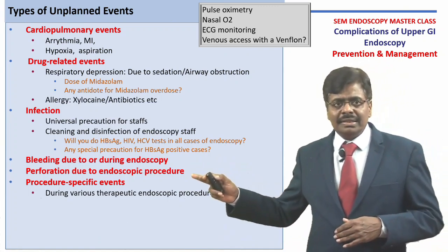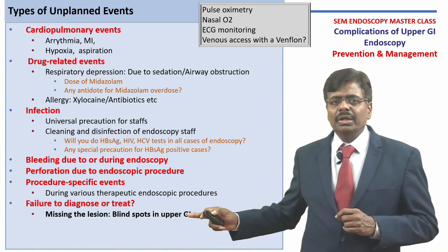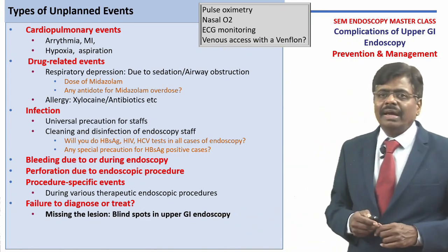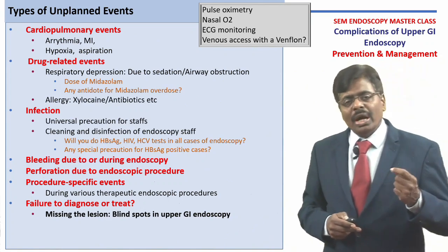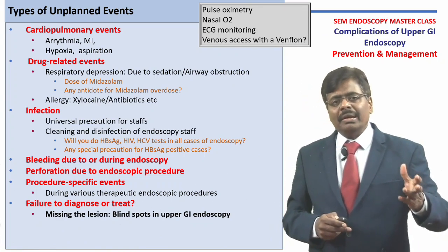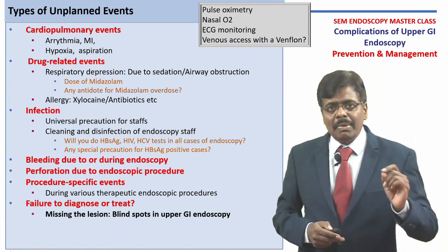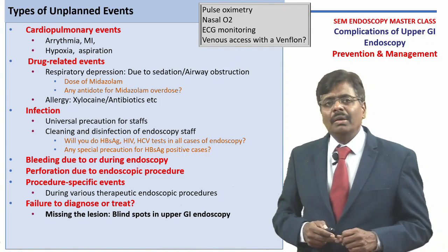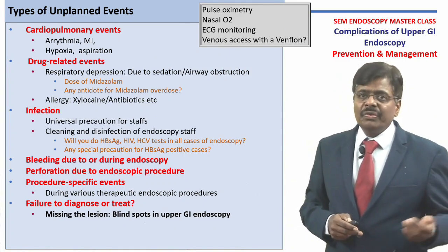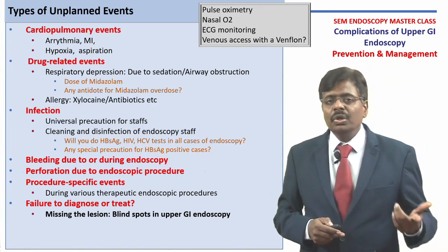Let us discuss the more major complications in detail later, but let me address a very important issue. Failure to diagnose or treat, or failure to recall a patient, is a very important aspect I want to highlight. For example, you have a patient in whom you have seen an ulcer and you think it could be benign, but you think it is better to bring the patient back after a fortnight after giving anti-ulcer treatment. Better you keep a note of that patient and try to recall, because if the patient is symptom free, he may not come back to see you, and a few months down the line he might come back with a larger ulcer or even a malignant transformation and blame you for not calling him.